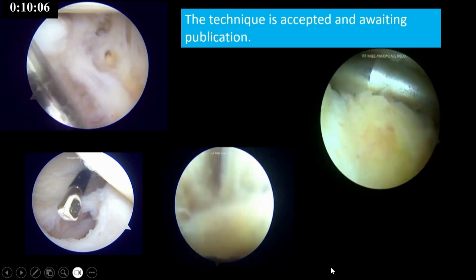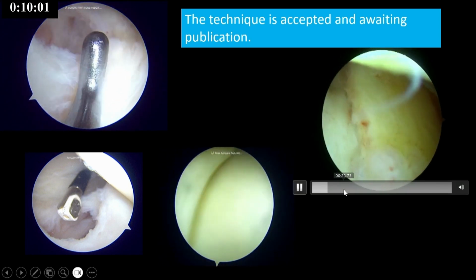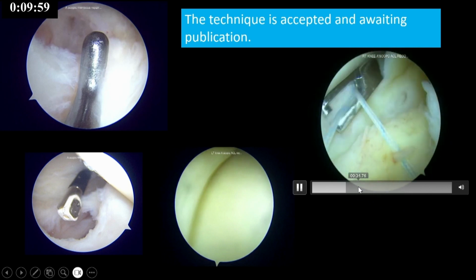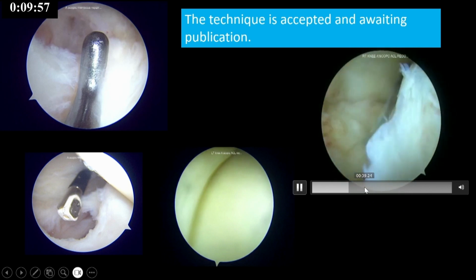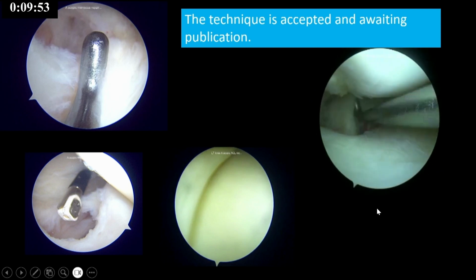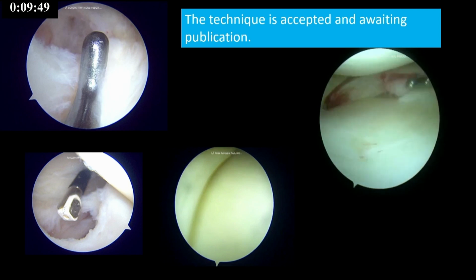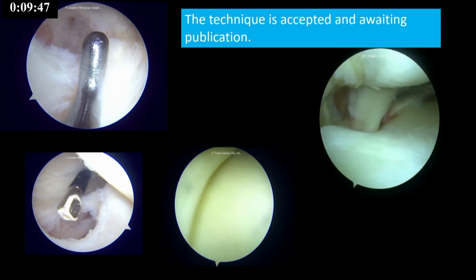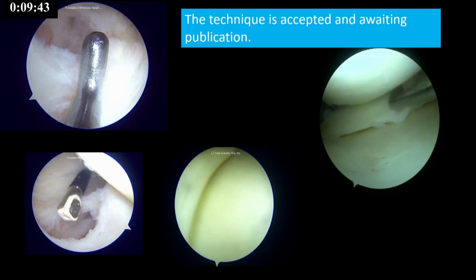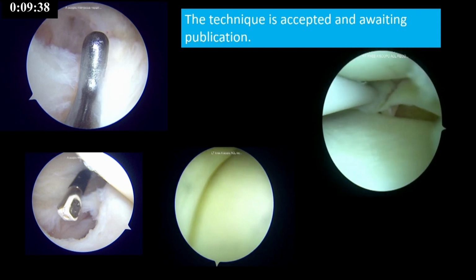So if you consider now with the meniscus tear, you have a similar kind of injury where you have a posterior ramp. So I'll skip the technique of the posterior ramp. That is the ramp repaired by the technique shown by us. And this patient also had a double meniscal tear with a flap tear. Now, since we have a posterior capsule intact on the posterior side, these tears can be dealt with by a mere anterior approach using all inside devices. And this was then fixed to the capsule.